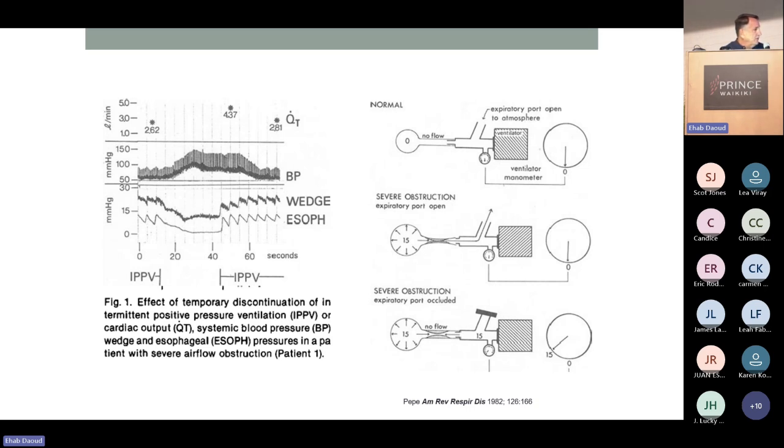And then, as you know, one way of detecting that is to do an expiratory hold at the end of exhalation. The ventilators can do this automatically for you now using a feature, but even with the MA1, we could have done this manually on the exhalation limb. That allows these pressures to equilibrate, and now your manometer is going to show you that positive pressure.